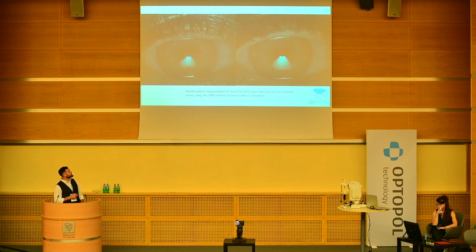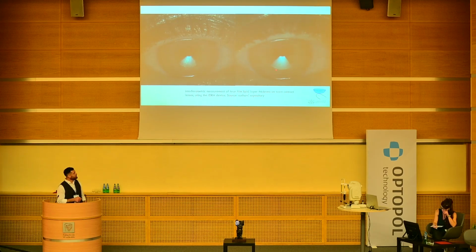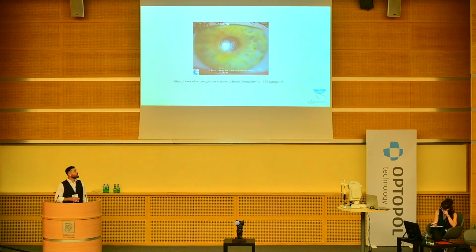You can see that the lipid part of the tear film behaves totally differently in the same patients, day by day. And from time to time, again from the clinical perspective, we can see patients with a lot of deposits on the contact lenses.